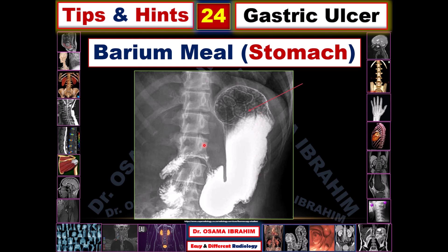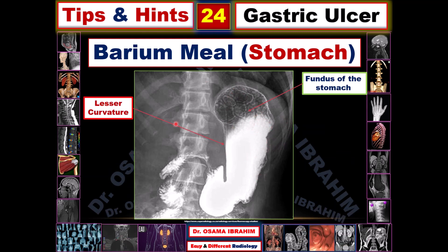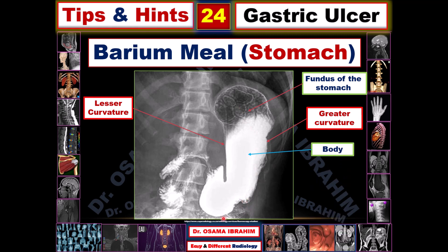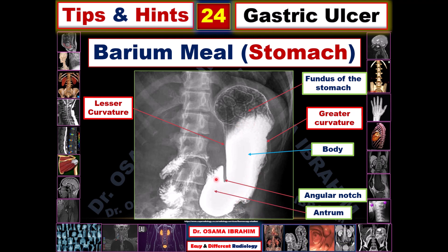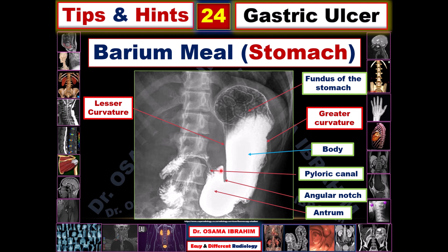Looking at the anatomical parts of the stomach: this region represents the fundus of the stomach. The lesser curvature is appearing in the medial aspect, the greater curvature in the lateral aspect, and this is the body of the stomach. This arrow refers to the angular notch between the gastric body and the antrum. This part is the antrum, which is distal to that angular notch, and that arrow refers to the pyloric canal.